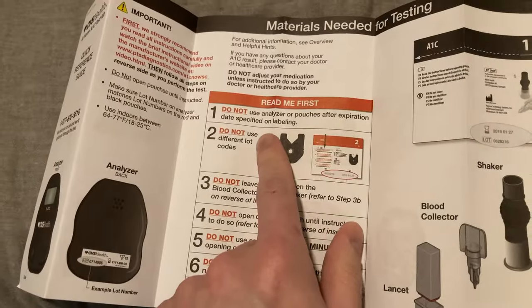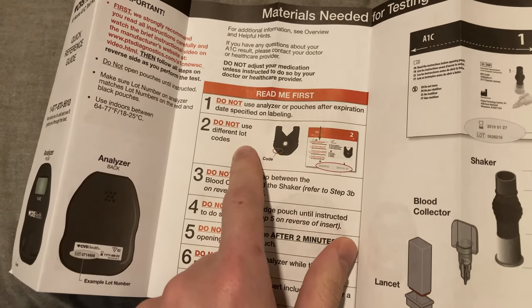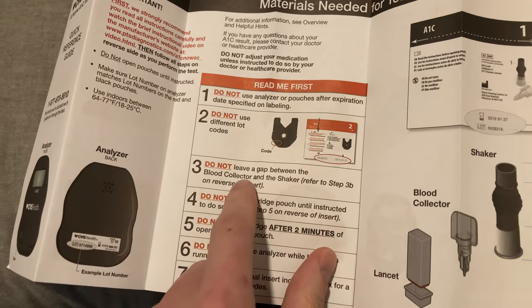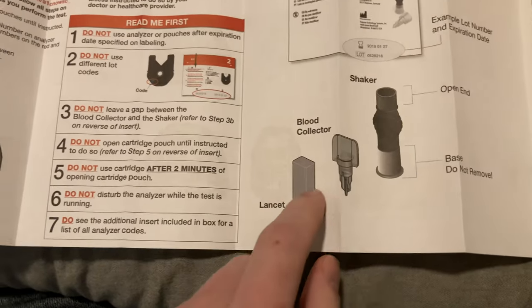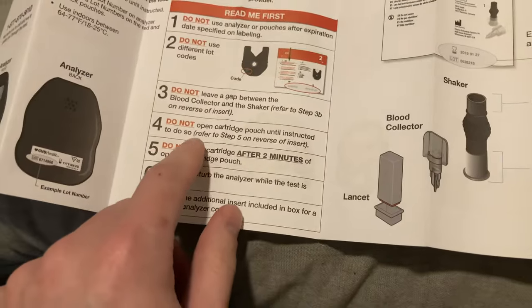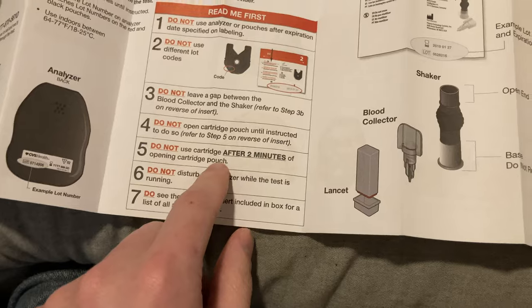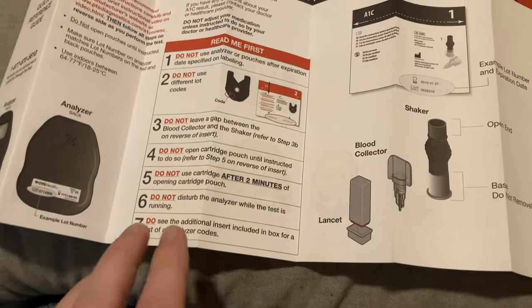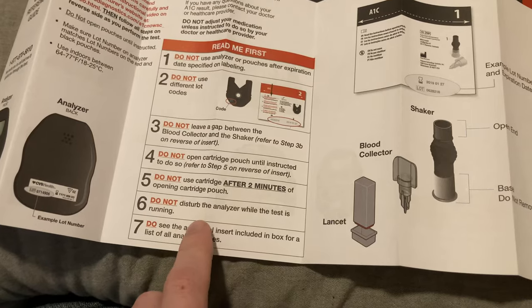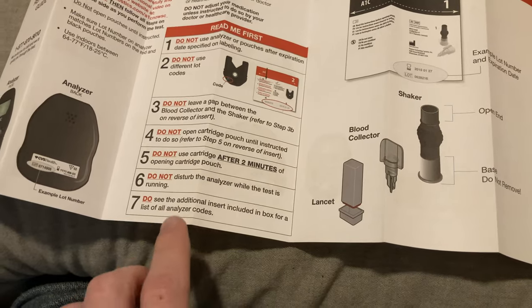It tells you everything not to do. Don't use the things if they're expired. Don't use it if the lot code doesn't match. Don't leave a gap between the collector and the shaker. More on that in a moment. Don't open the cartridge until instructed to do so. Do not use the cartridge, so the part that goes in the machine, if you've opened it. After 2 minutes, it starts to oxidize and it will ruin the results. You're not supposed to bump the tester while it's running. And there's a list of codes.